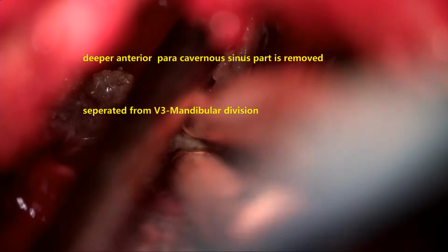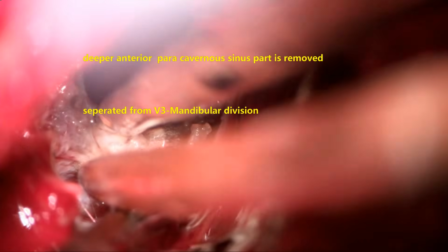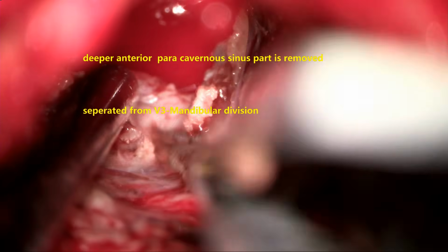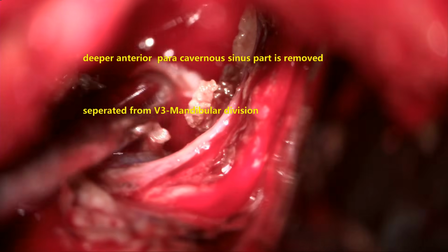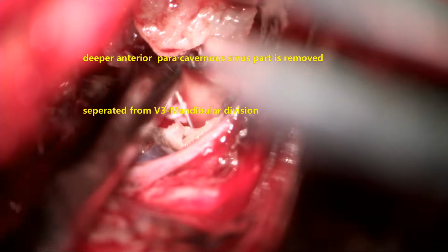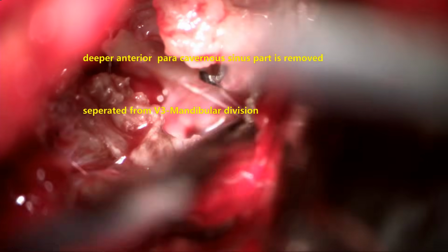Once that is done, now the anterior and basal part of the tumor we need to take out, that is the anterior most part and basal part of the tumor, which is being debulked. Now all these steps are being done under high illumination and high magnification.